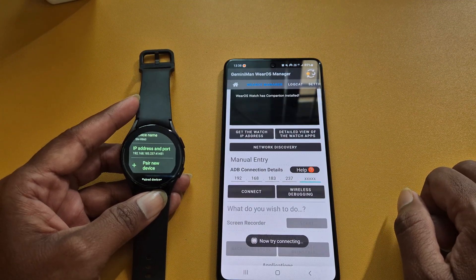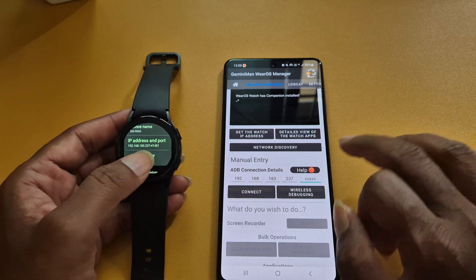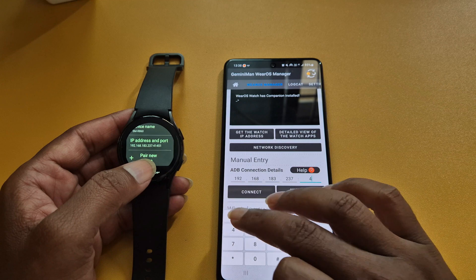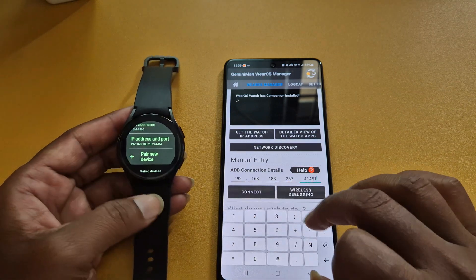Now on the ADB connection screen, you have to enter the last five digits of your IP address. Enter the numbers and click on Connect. You can see your watch is now connecting with your smartphone.